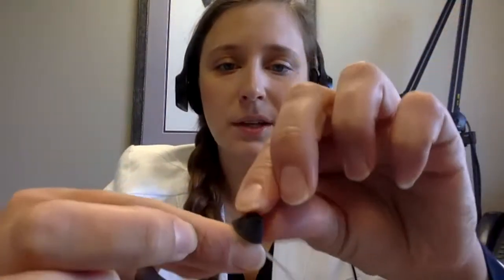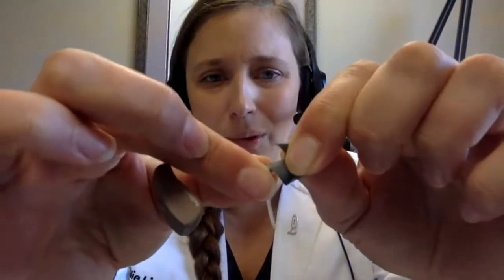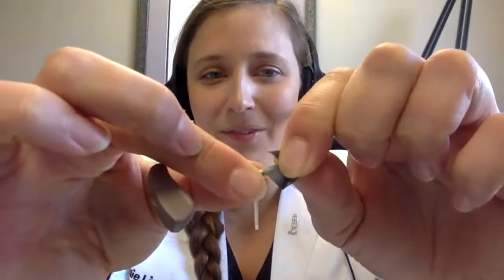So if you have a filter, nine times out of ten it has something called a dome on the end. There can be different couplings here, so we'll talk about the other two that might be on there, and how to deal with those. So if you have this on the end, you're going to take it off. It should give you a pretty good pull, because we don't want it coming off in your ear. So it comes off a little tough. If you're a little nervous, that's actually a good sign that it was on there nice and secure.